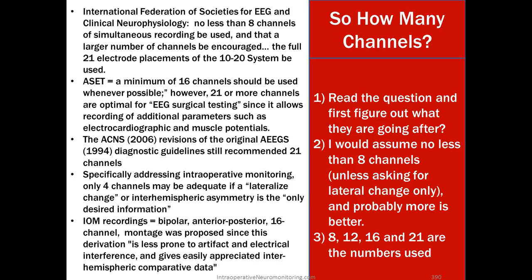Specifically addressing intraoperative monitoring, only 4 channels may be adequate if a lateralized change or an interhemispheric asymmetry is the only desired information. And then another source says IOM recordings use a bipolar, anterior to posterior 16-channel montage, since this derivation is less prone to artifact and electrical interference and gives easily appreciated interhemispheric comparative data. So you can see that there are a number of different recommendations for how many channels we should be using for EEG monitoring. So you're going to want to read the question first and figure out what they're going after.